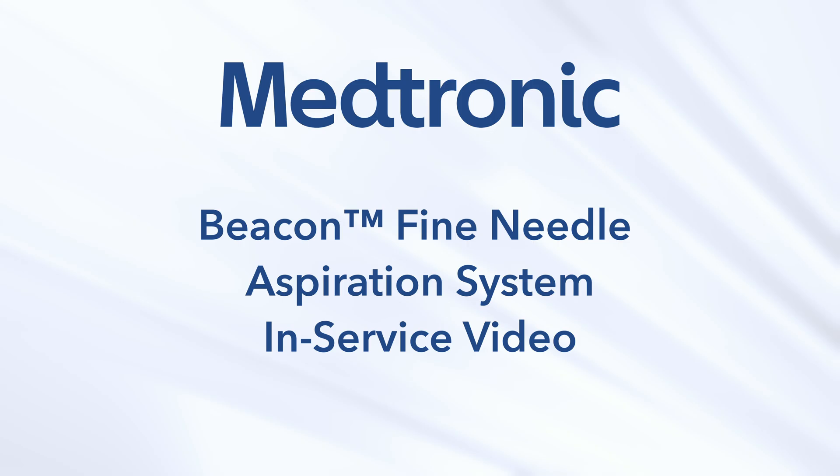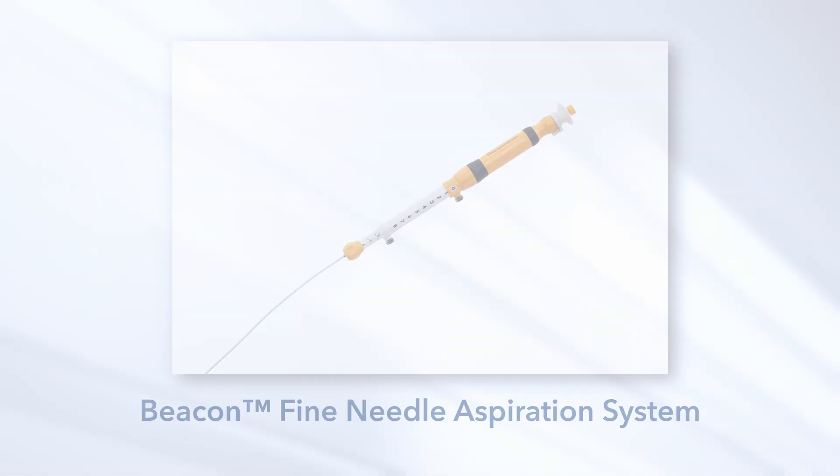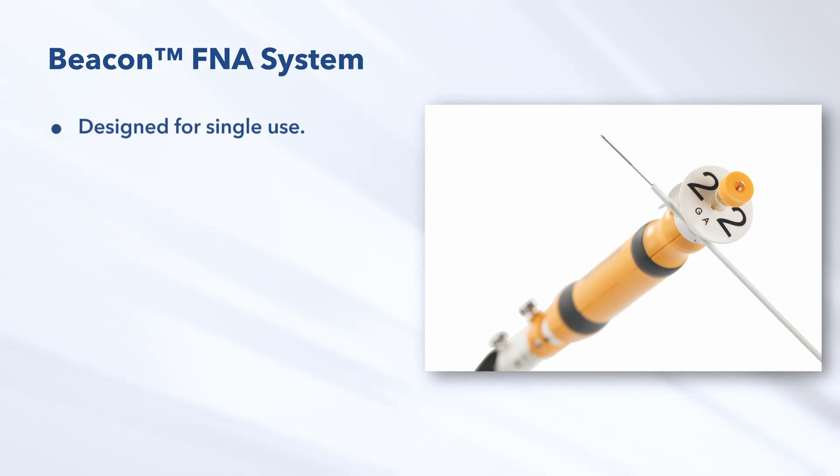Welcome to the Beacon Fine Needle Aspiration System in-service video. In this video, we will cover the essential information about the Beacon FNA device, its setup, and the procedural steps to ensure effective and safe usage during endoscopic ultrasound procedures.